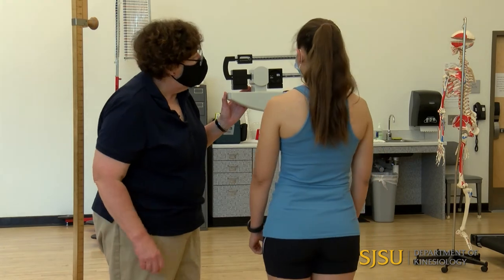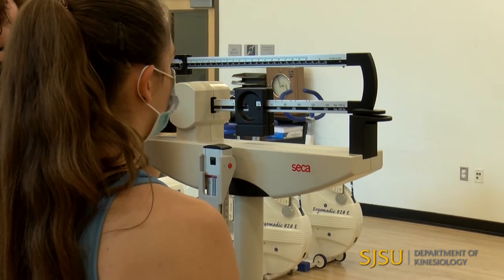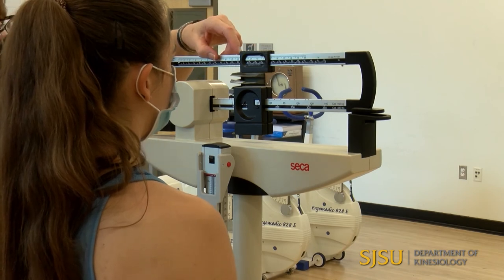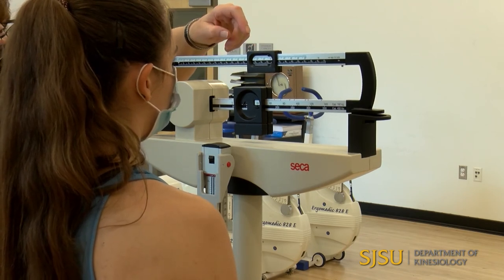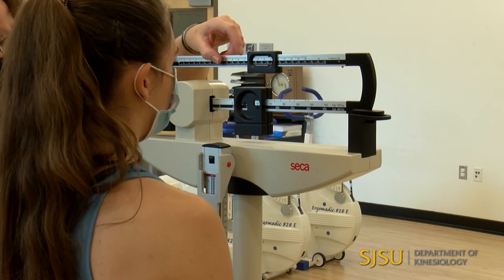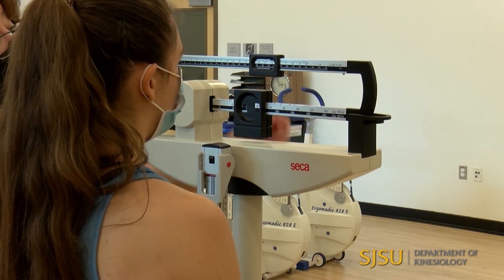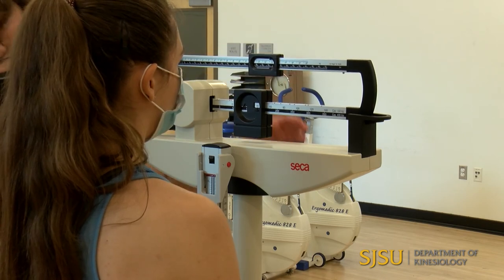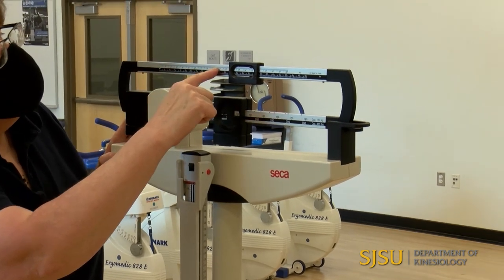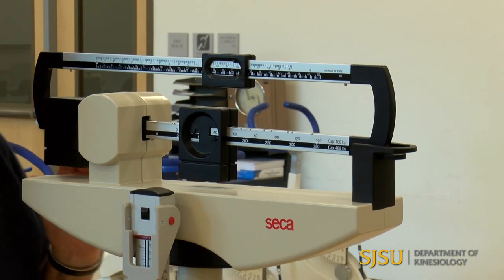She's going to step up and I'm going to measure in kilograms. The bottom silver is 40 kilograms and the top silver goes 20 kilograms, so I'm going to slide this along. I can pinch this to see if it's level. I'm going to move to the right — okay, I think we're good there. She can step down. So I have 40 kilograms on the silver scale plus 14.7, giving us 54.7 kilograms.